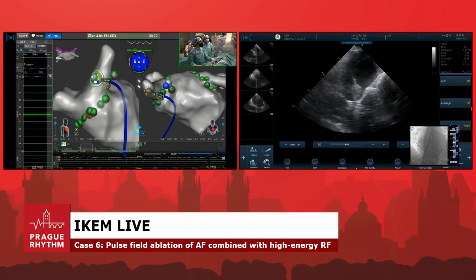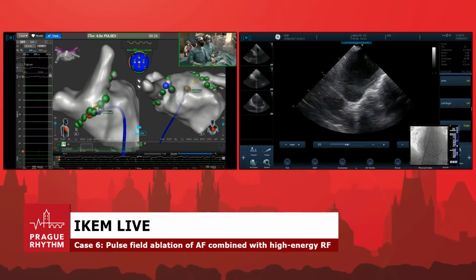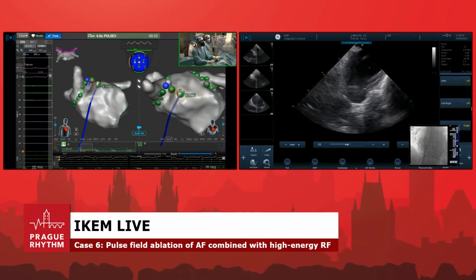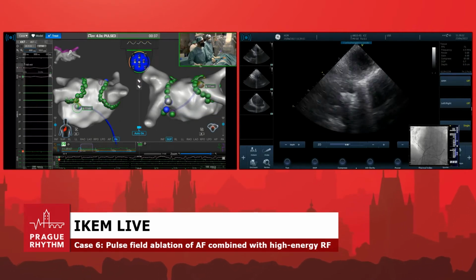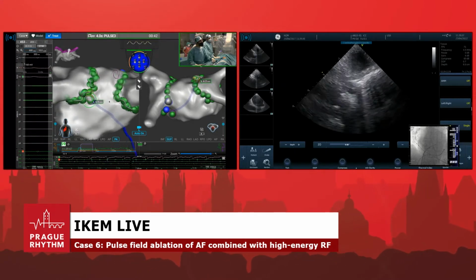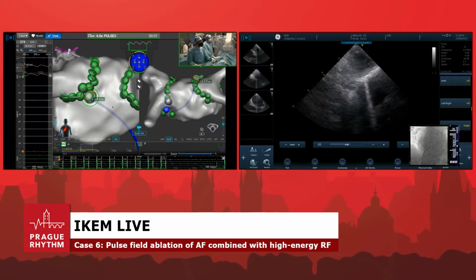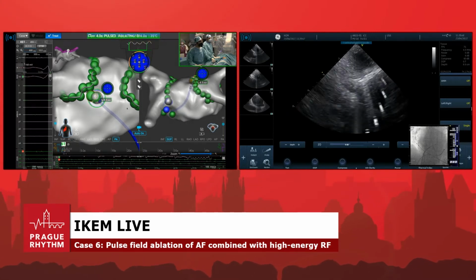Can we see signals on the screen? We can pace because the patient is still in arrhythmia. I think we can do the posterior wall now. You have about 6 to 8 minutes to show, so maybe we can do the posterior wall in the meantime. And if the patient doesn't convert to sinus rhythm or to an atrial tachycardia, we will cardiovert him.